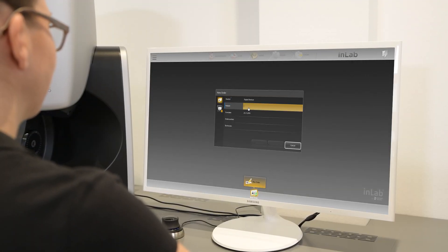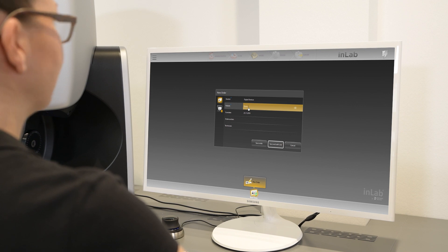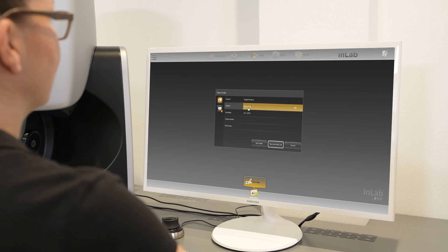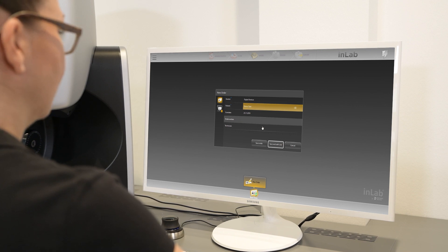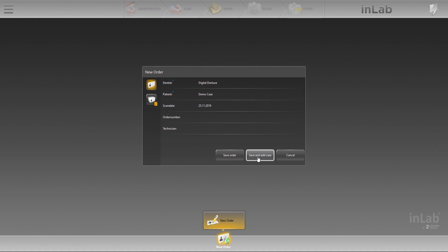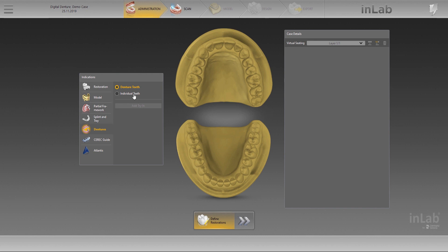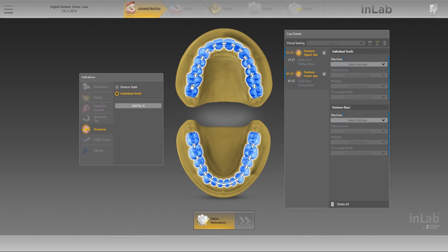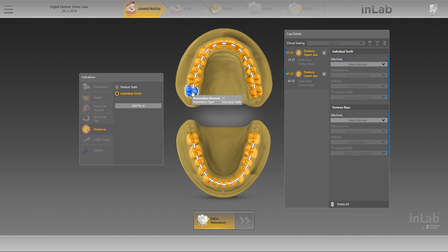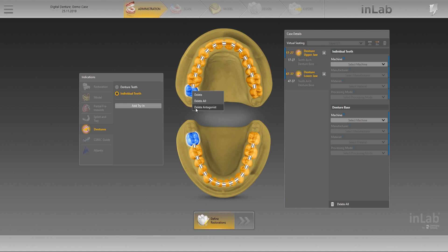Start by creating a new case and enter the dentist and patient data. In the administration phase, select Dentures in the first column of the Indications menu. In the second column, choose Individual Teeth. As soon as you click on the dental chart, a denture case is automatically created in the upper and lower jaws.